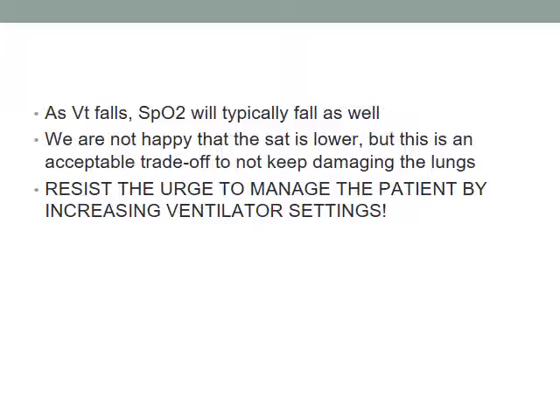Yes? You said that the patient was hypertensive. Is there a certain range that we're looking at for blood pressure while on the ECMO? No, VV ECMO is just standard management. This is early in this patient's management, very soon after we started. We're still working on sedation and all sorts of things. So I'm not afraid of hypertension.